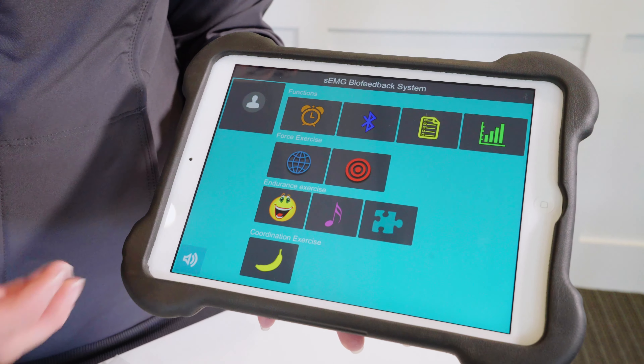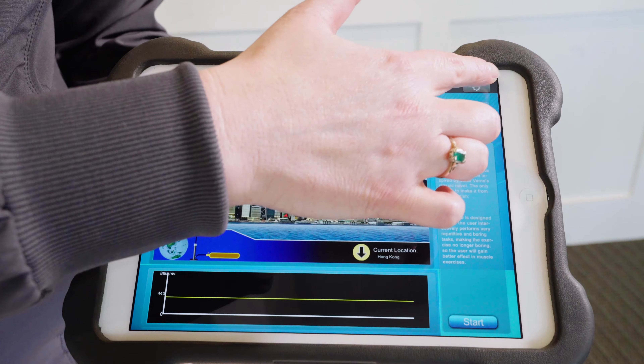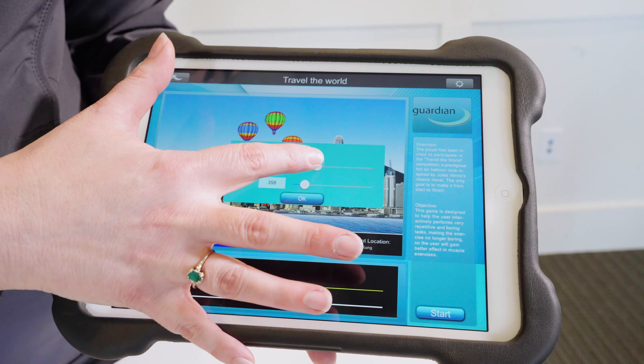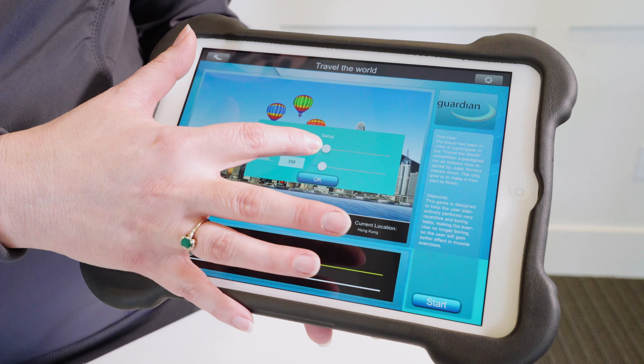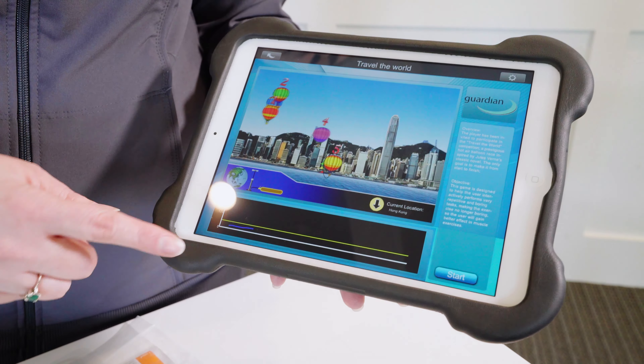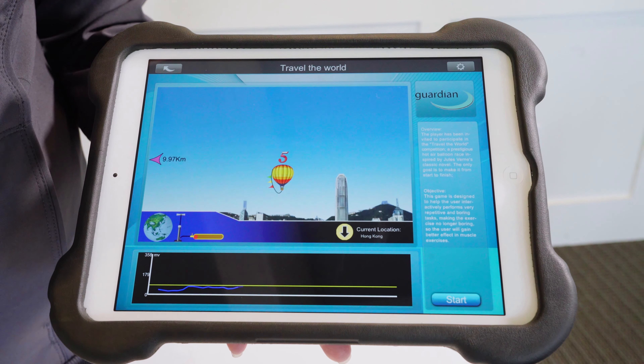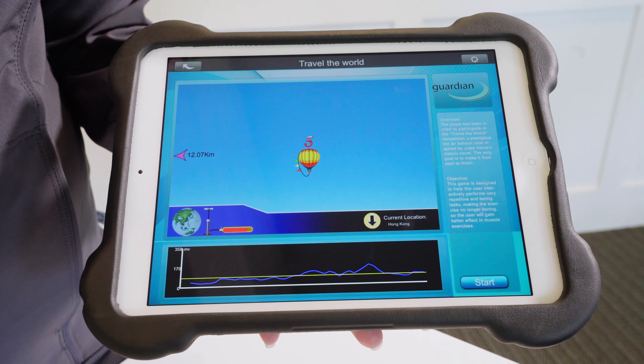The iPad app is also great for gamification, whether with adults or with pediatrics. You'll be able to set your games and dial them in for your patient — you'll find that information in the resource guide with our course. As your patient contracts those muscles, they become successful when they hit the targets in the game. Games can be really motivating and this just gives you another tool within your therapy session.